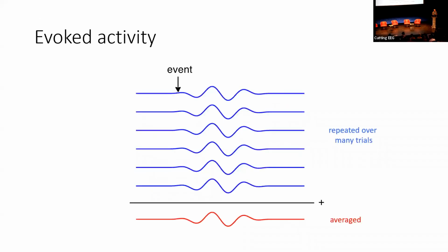Yes, this is really a relevant question. How do we analyze more naturalistic situations? What we often do is show the same stimulus, and the subject is basically sitting in a dark environment, looking at the screen fixation cross, nothing happening, stimulus flashes, nothing happening, stimulus flashes. The stimuli are relatively far spaced, a few seconds apart. In that case, we know that the brain has already processed the previous stimulus when the next one comes on. So that's why the ERP rationale works.